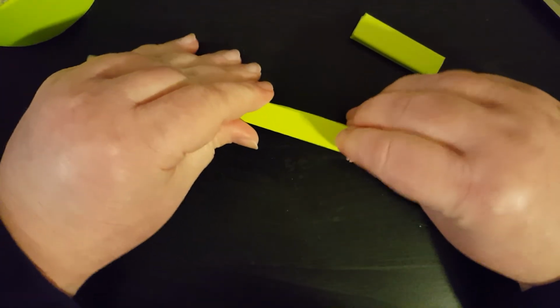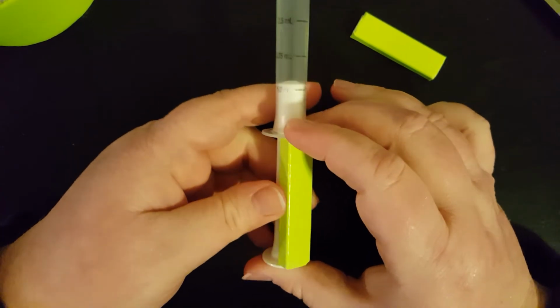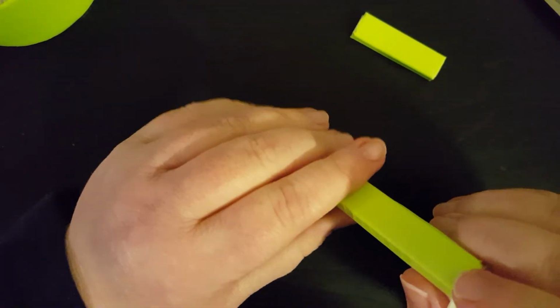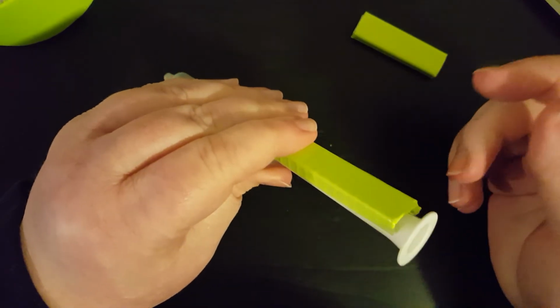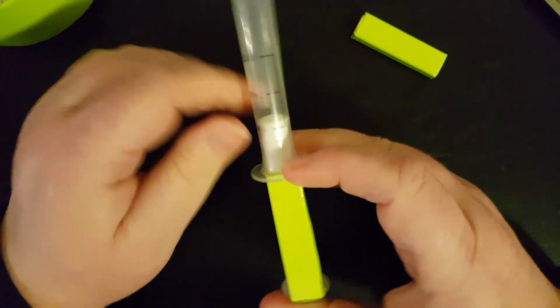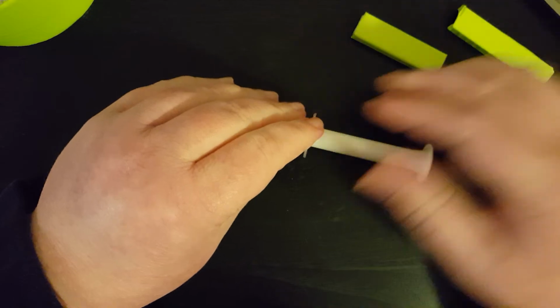I can stick it in there and measure out a dose of medication. Anytime I need 5 milliliters of medication of some kind of liquid, I would just pull up, stick it inside between or along the plunger, push down until it is nice and snug, get any excess out of there, okay? And I have 5 milliliters inside my syringe.